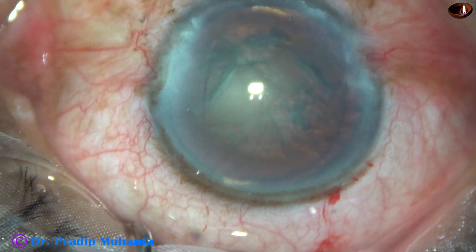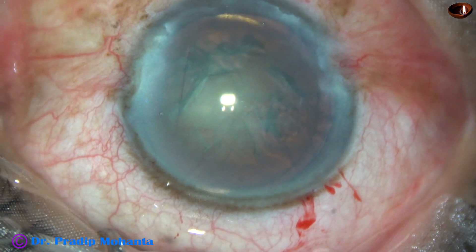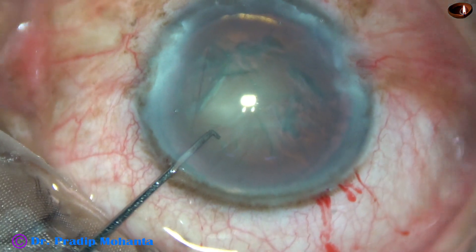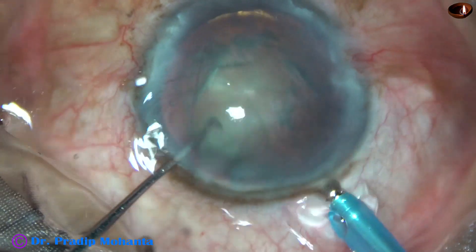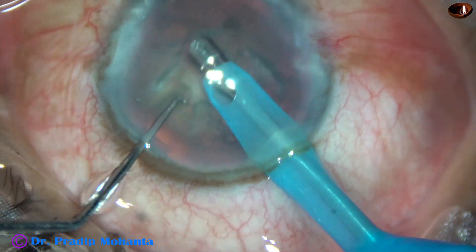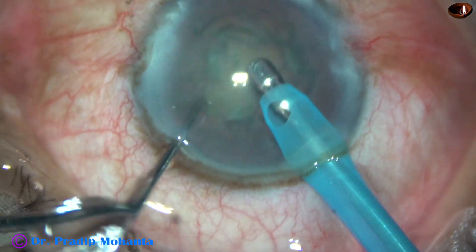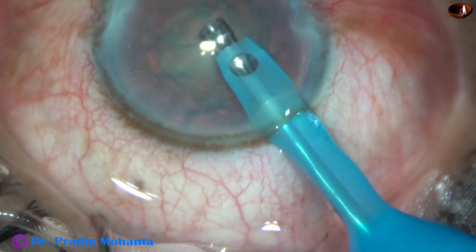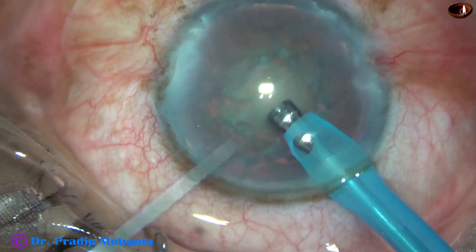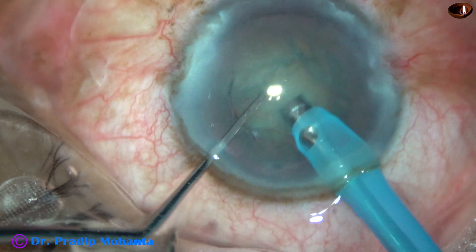Some more viscoelastic is applied in the anterior chamber. Then the tip of the FACO needle is introduced into the anterior chamber with its bevel down. Some superficial cortical lens matter is removed. The handpiece is then turned to make the bevel up, and the nucleus is divided into pieces by direct horizontal chop.